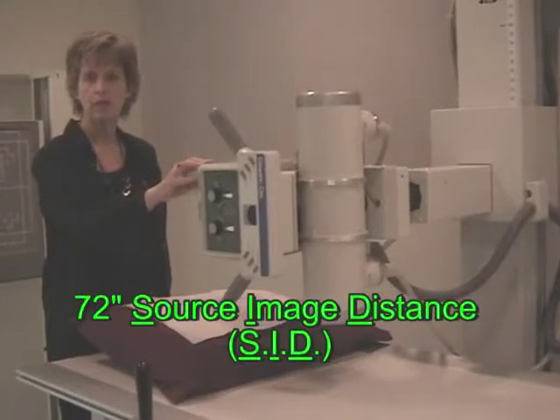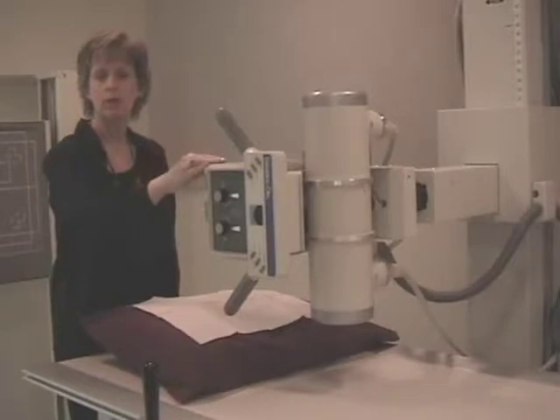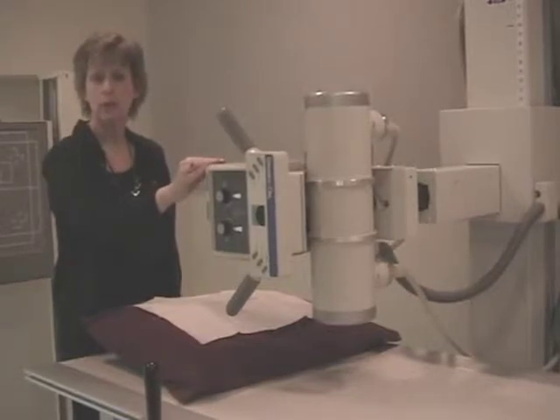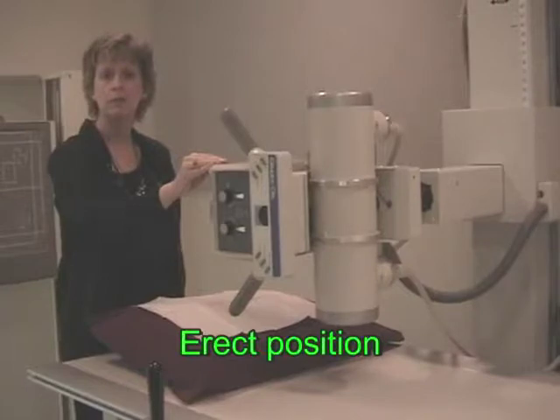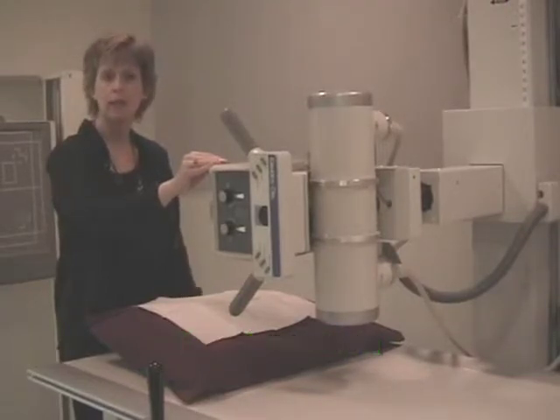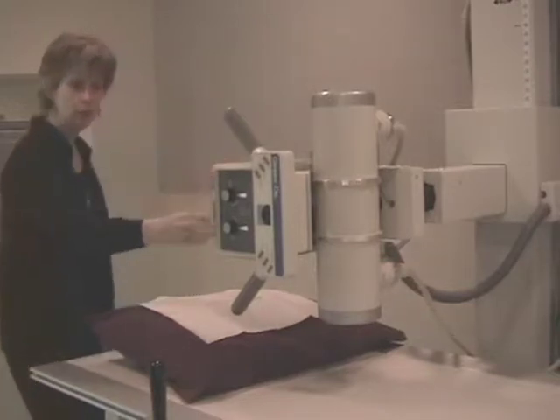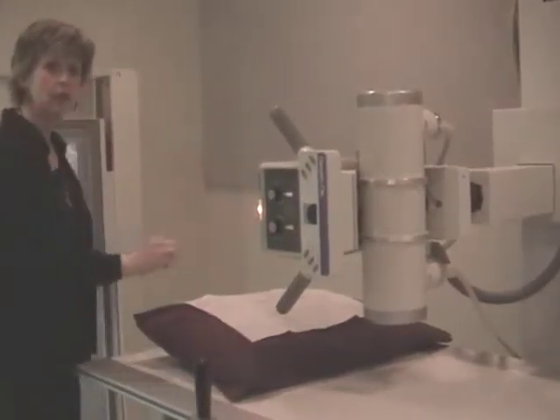Very important to have 72 inches whenever you can. That will minimize the magnification of the heart and prevent the appearance of engorgement of the large vessels. So 72 inches. And whenever possible, you need to do the patient in an erect position. That allows the lung fields to drop down further to get full expansion. And I like to set my room up before I get my patient. I set my tube to 72 inches.